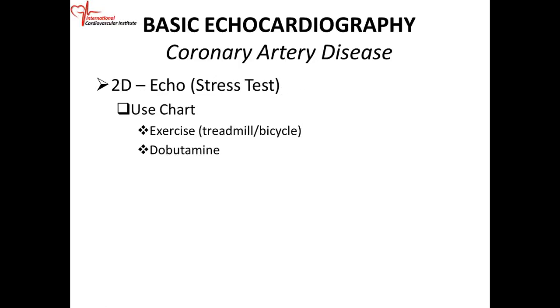Okay? Now, stress testing is one of the echo tools we use to diagnose coronary artery disease. When you do a stress echo, essentially what you're doing is a stress ECG and a stress echo combined, and you put them together to determine the likelihood that this patient has a blockage.